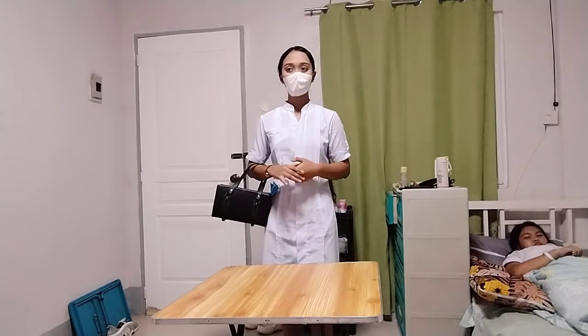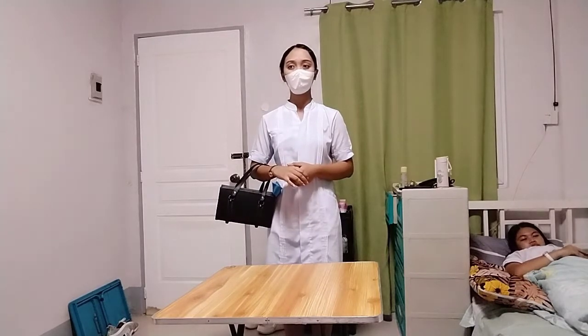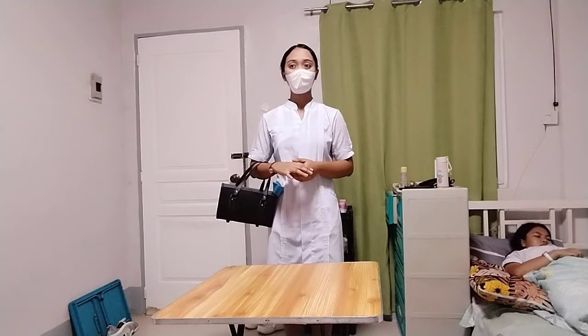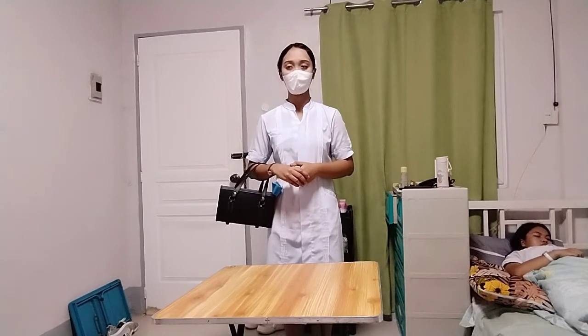For the documentation, document the collection of the sputum specimen on the client's chart. Include the amount, color, consistency (thick, tenacious, watery), and presence of hemoptysis, or blood in the sputum, the odor of the sputum, any measures needed to obtain the specimen, for example postural drainage, and any discomfort experienced by the client.